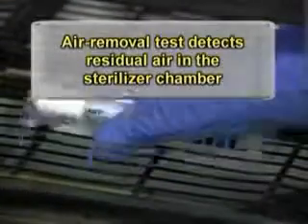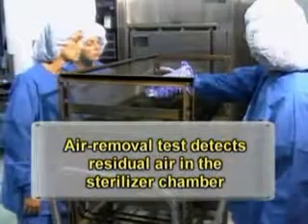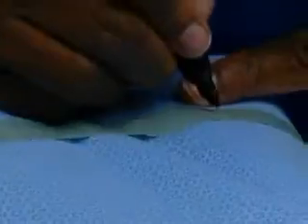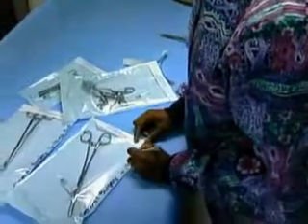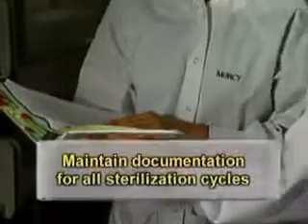An air removal test should be performed daily in a pre-vacuum sterilization cycle. The air removal test is designed to detect residual air in the sterilizer chamber. Each sterilized item should have a lot control number imprinted to identify the sterilizer, cycle, or load number, and the date of sterilization. Documentation for every wrapped or unwrapped sterilization cycle should include results of routine biological monitoring of sterilizers.